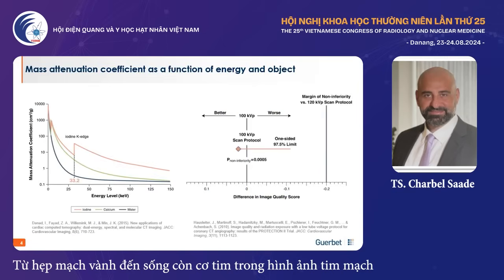We're looking at coronary CTA. The important aspect is that we should always scan our patients, especially in Asia. Patients are usually below 75 kilos on average between males and females. So we should always be scanning less than 100 kVp protocol.